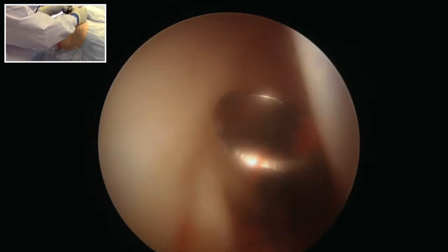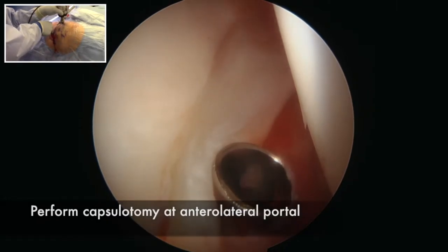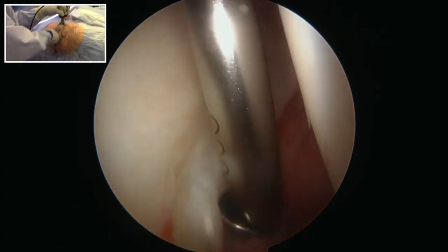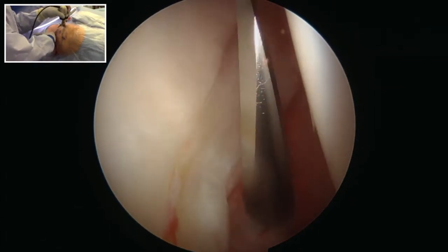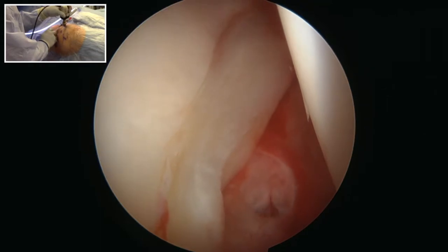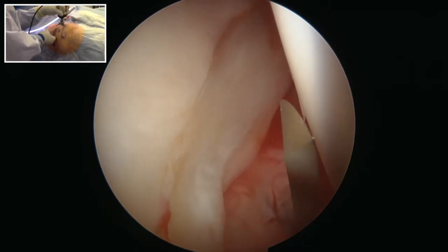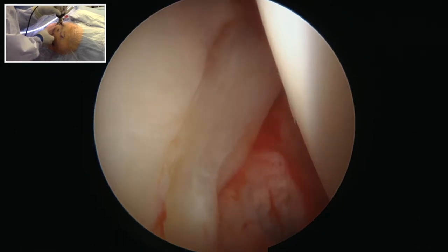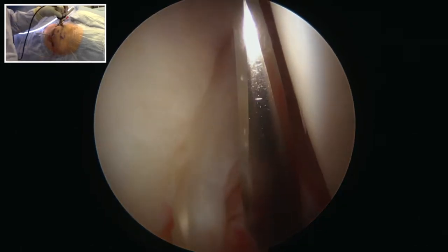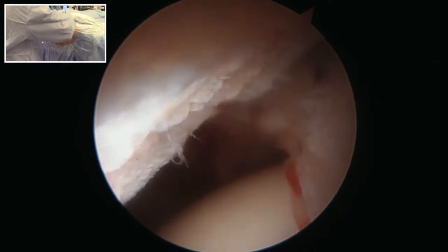Once you've established your anterior portal, you may switch the camera to the anterior portal to evaluate the location of your anterior lateral portal. Here, the anterior lateral portal is safely between the labrum and the femoral head. At this point, we'll perform a capsulotomy using a capsulotomy knife placed through the cannula. The cannula is then withdrawn and the knife is freely manipulated within the joint. We will first make a small incision posteriorly and then bring the incision anteriorly to establish an inter-portal capsulotomy. The goal is to create a capsulotomy with clean edges parallel to the labrum, approximately eight millimeters to one centimeter off the labrum.